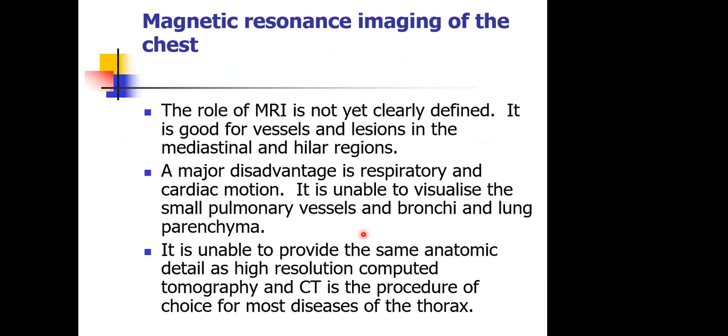That takes me next to MRI of the chest. In our opening remarks, we said the role of MRI is not yet clearly defined when it comes to chest imaging.